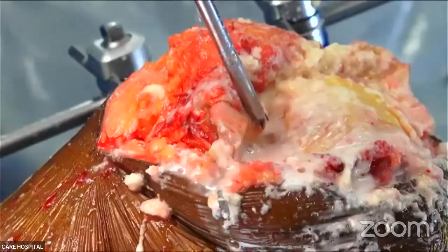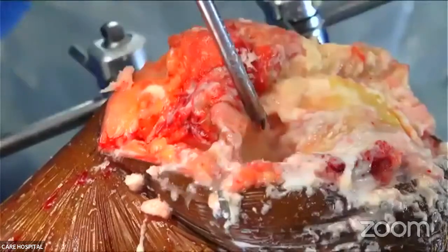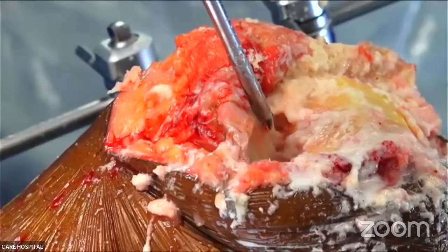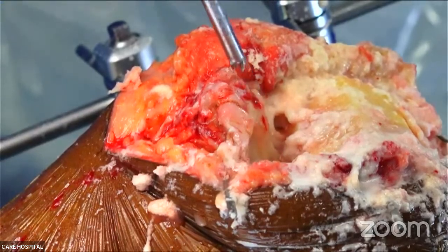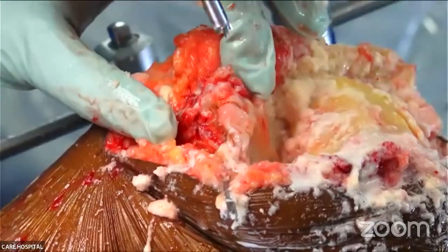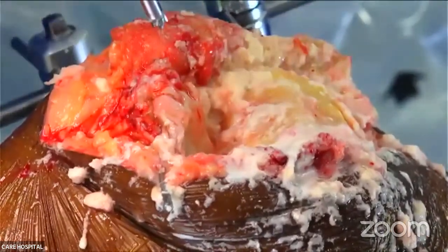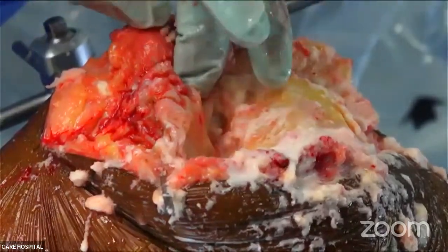No, it will finish. No, it will finish all the cuts in the femur without a manual guide. So the tibial spine is coming in the way, so we'll just remove that. If you want to stop something and then jump, then you have to do something. If you don't want to jump anything, it will keep on going.